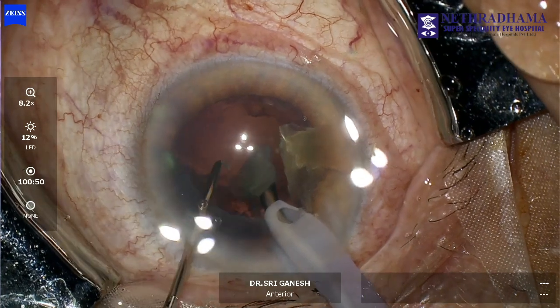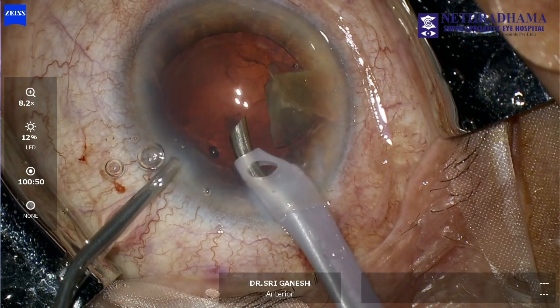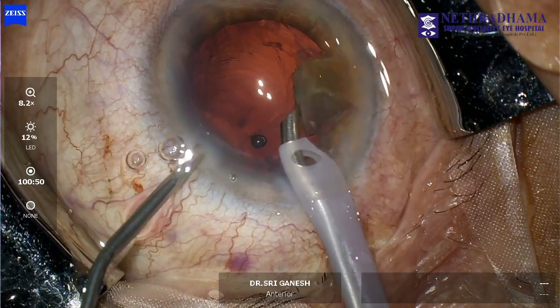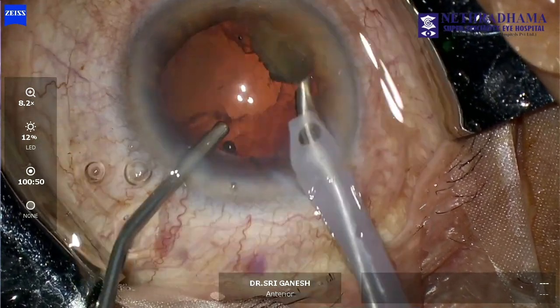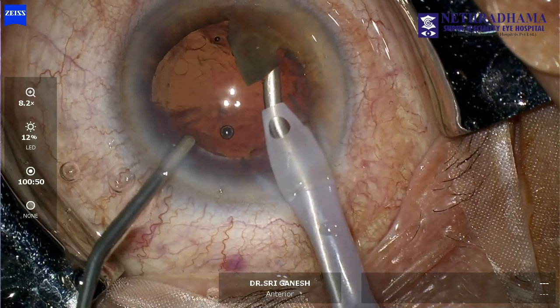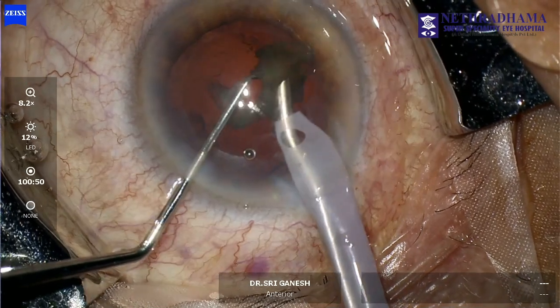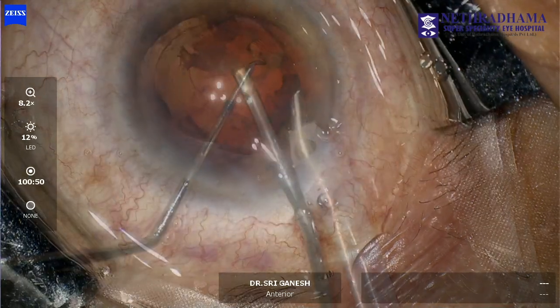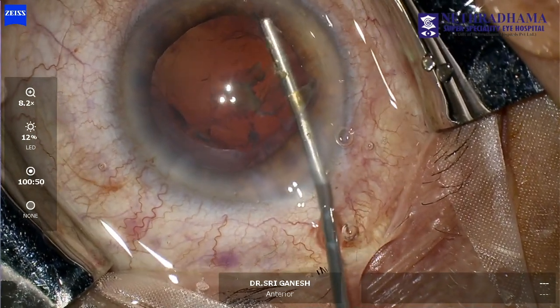Bring the fragment away from the area of the PCR and then put in viscoelastic to tamponade the vitreous from the AC. Then, very carefully, if there is no vitreous, you can go ahead and remove the last fragment. If there is vitreous in the AC, you will have difficulty removing this fragment. The fragment is removed.